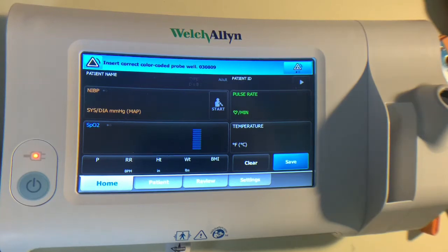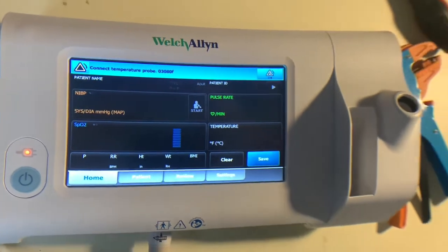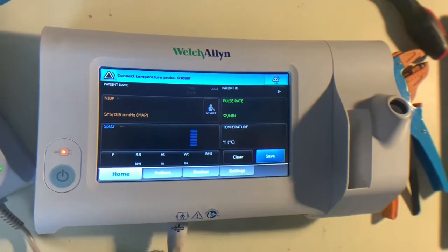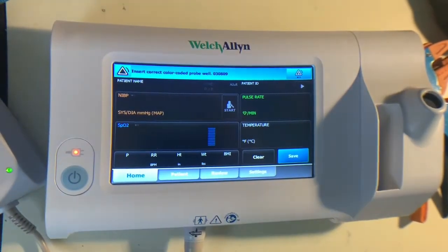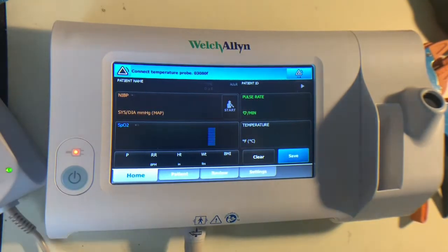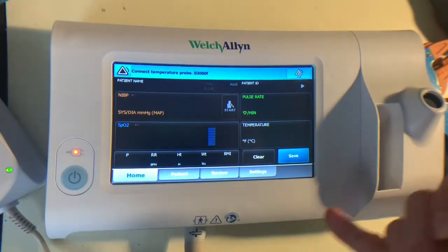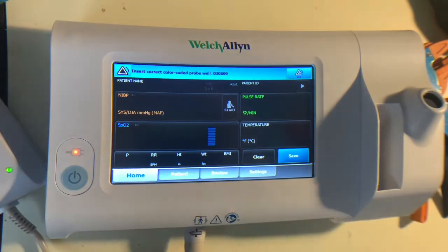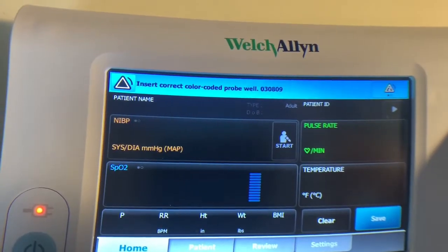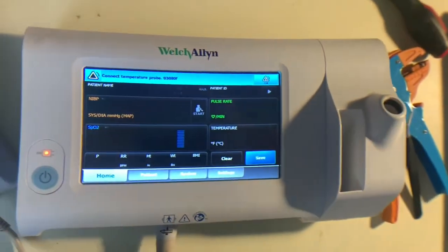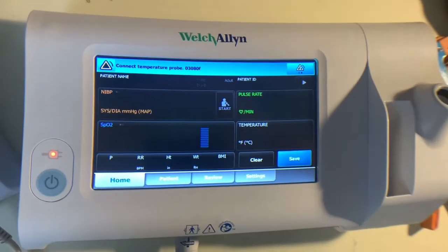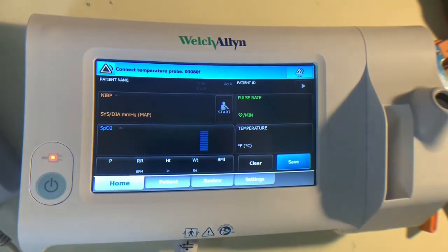In this video I want to go over the networking behind the Welch Allyn spot monitors and how to get them connected to a network. This monitor is fresh out of the box, hasn't been used, doesn't have a thermometer or the SpO2 sensor connected so it's going to keep complaining that it doesn't have those things, but we don't really need them for this video.